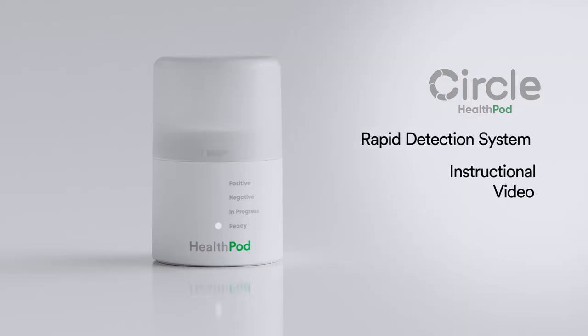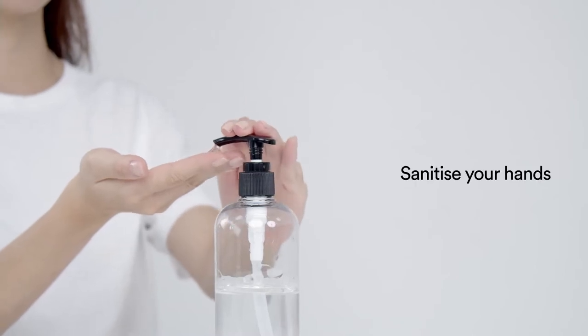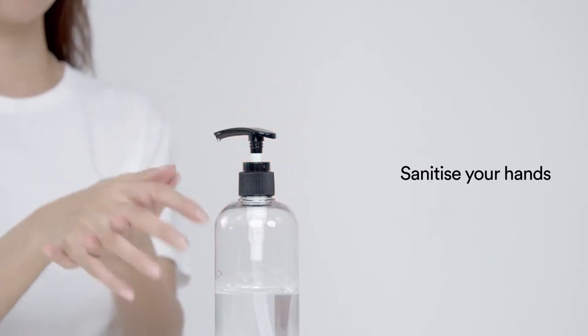This video will introduce you to the Circle HealthPod Rapid Detection System. Before conducting a test, sanitize your hands.